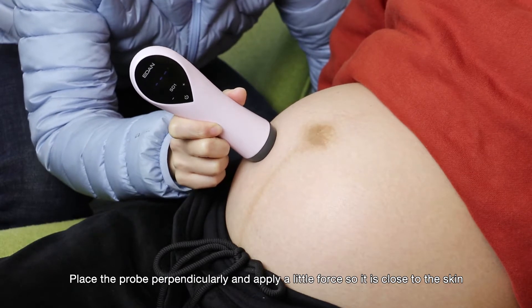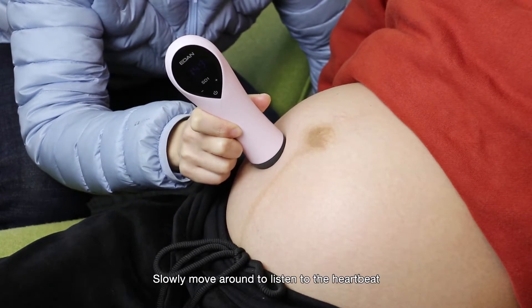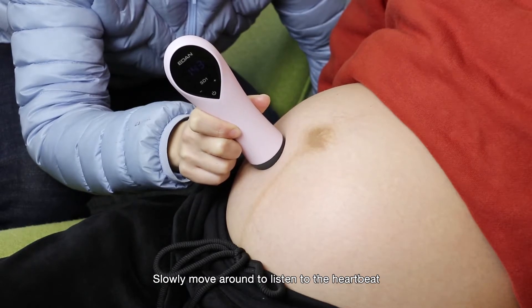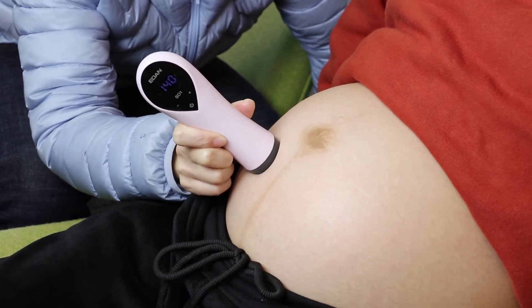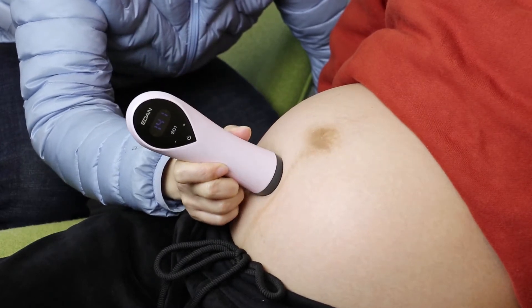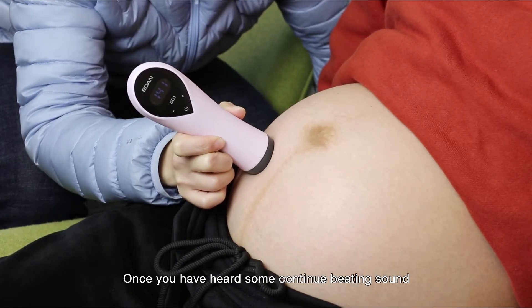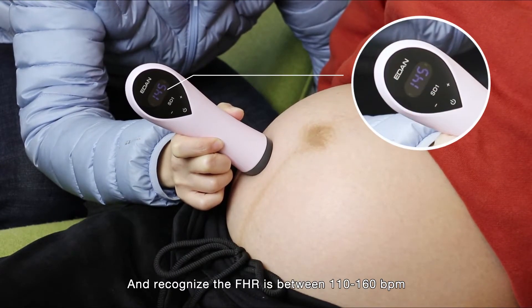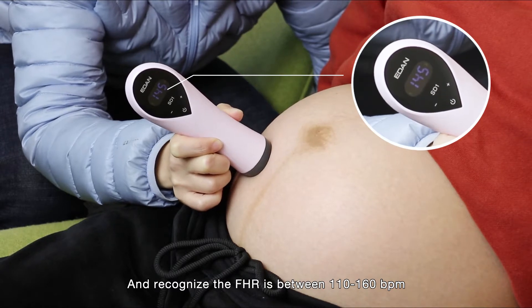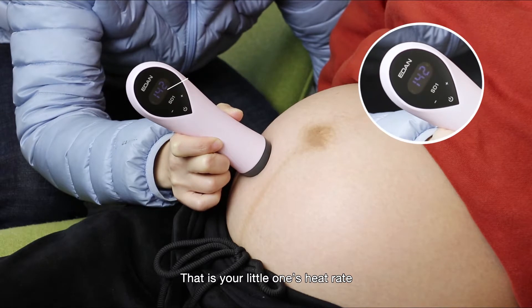Place the probe perpendicularly and apply a little force so it is close to the skin. Slowly move around to listen to the heartbeat. Once you hear a continued beating sound and recognize the fetal heart rate is between 110 to 160 beats per minute, that is your little one's heart rate.